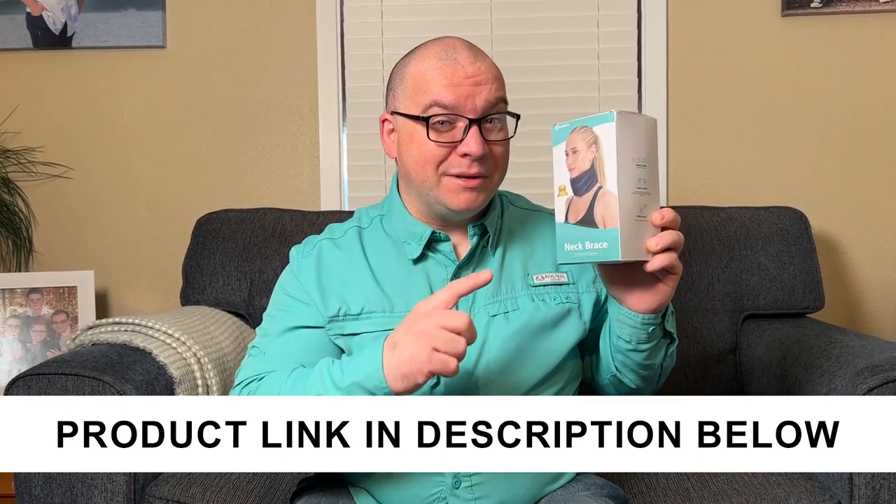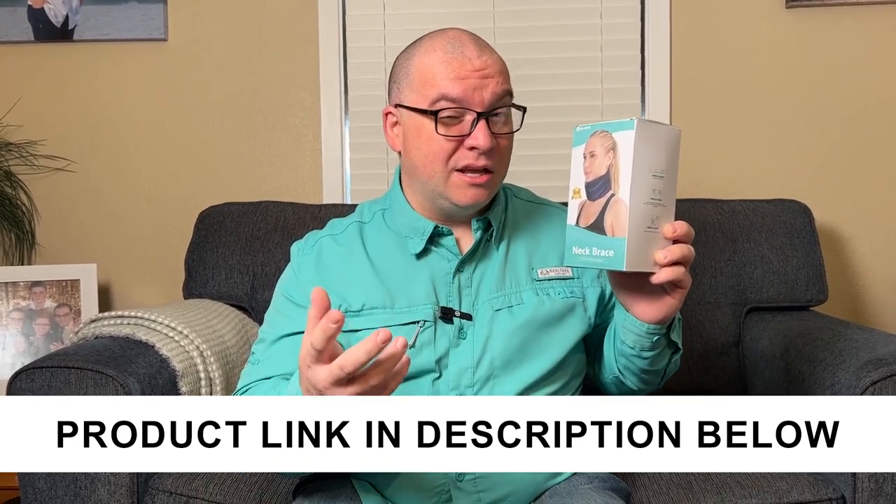This is the Blaybok neck brace. A company did send me this to take a look at, so I'll show you what you get with this and then I'll show you how it works.